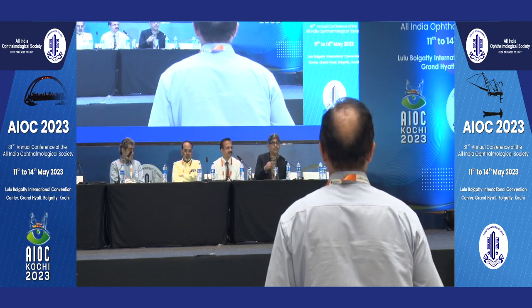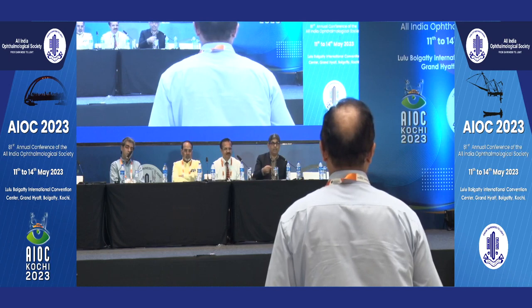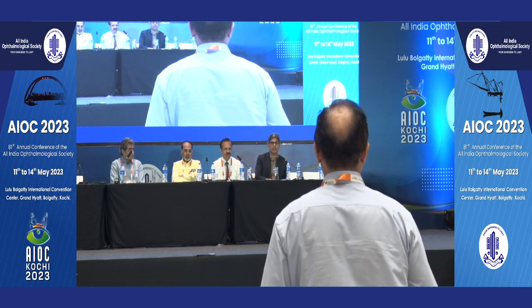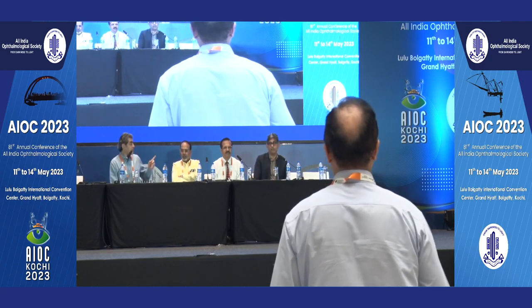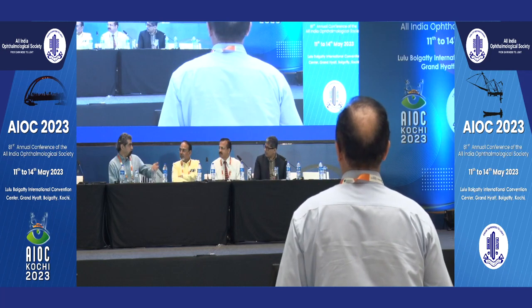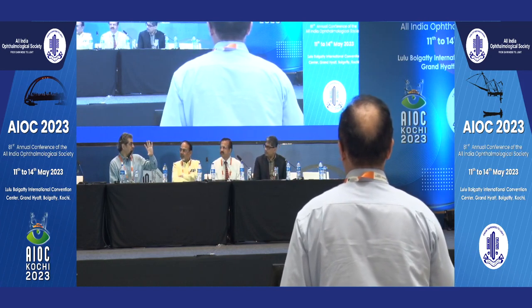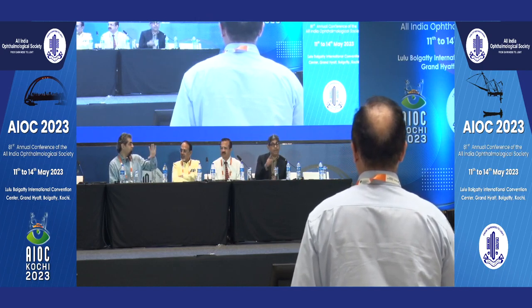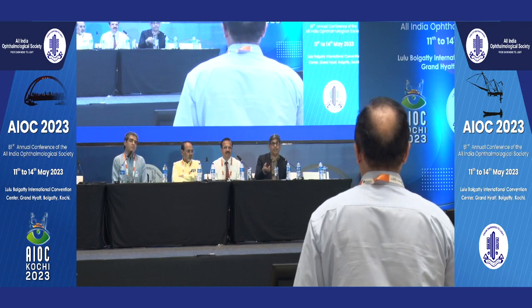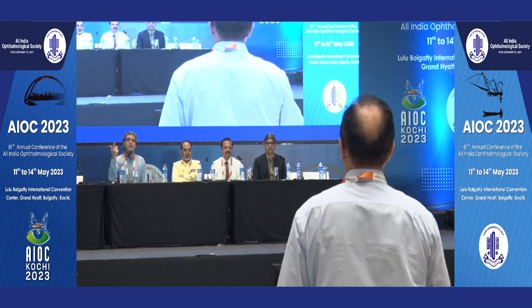Another thing is that these machines require regular calibration. Every 2 months, 3 months, the company person comes and does the calibration. That is very, very important. Besides the calibration of this machine, it also has to be calibrated every day in the morning once. Absolutely. Sometimes the machine pops up and says that it needs a calibration, and sometimes it's been 2 months or 61 days since the last calibration. The training of your technician is another thing, because the technician is the one who does the scanning and uploads it. You need to get back to the company as well.